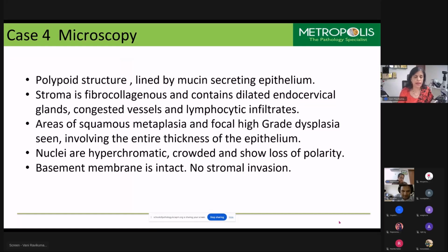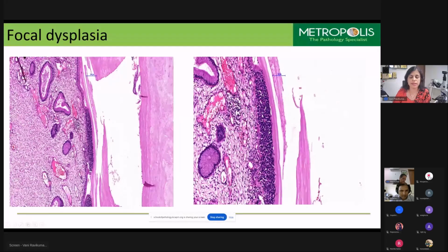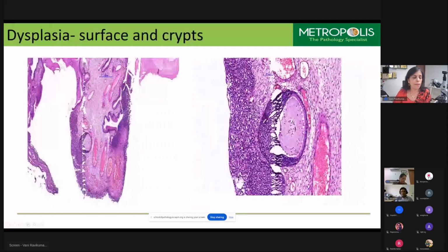And we saw these kind of areas. See, the whole thing here is all endocervical glands, the tall columnar glands with the basal nucleus and apical cytoplasm. Whereas here in this strip, you can see that there is something thick and looking different. So we are now focusing on this area, and see here, it is very dark. The minute you see very darkly stained cells, you have to think of dysplasia. Again, see the surface lining. The lining is endocervical only, the columnar. It is not squamous, so it is not the ectocervix. The whole thing is an endocervical polyp.